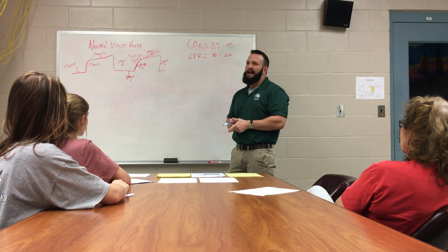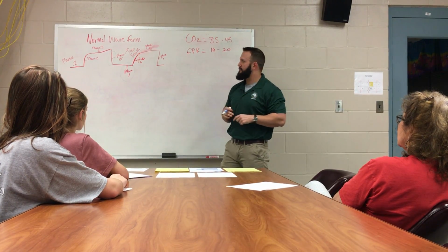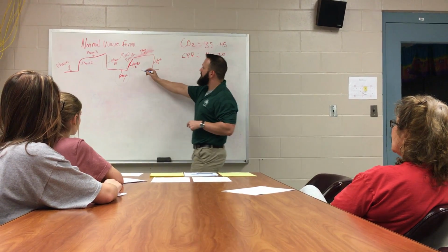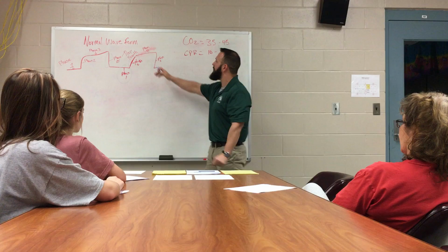So a real quick analogy is I have a hallway and there's no air movement. It's just a dead space in there until I open one door at the end and one door at the other end. Now I've created a draft and I can expel that gas through. That's where we're at right here. I'm at the beginning of the expulsion of gas through that dead space. So then we move from the dead space to phase 3. So when we go to phase 3, we all take that deep breath and we all start to exhale. As I do that big exhale, I enter phase 3. Phase 3 is going to measure my CO2 from my alveoli.